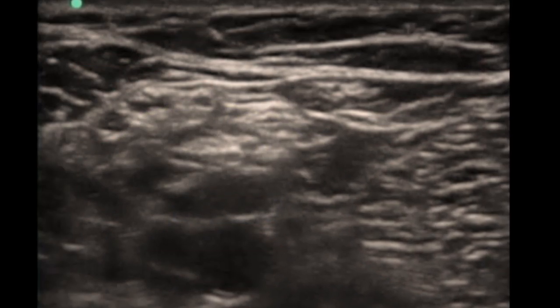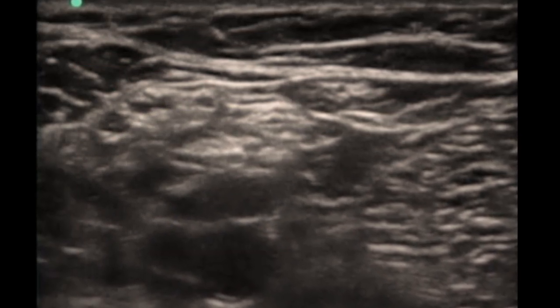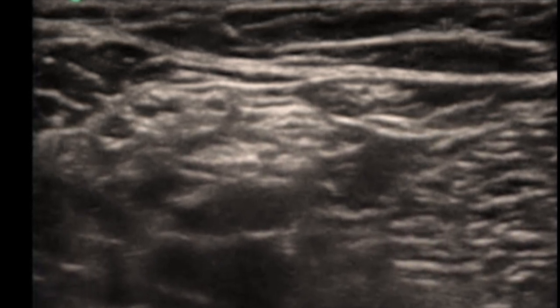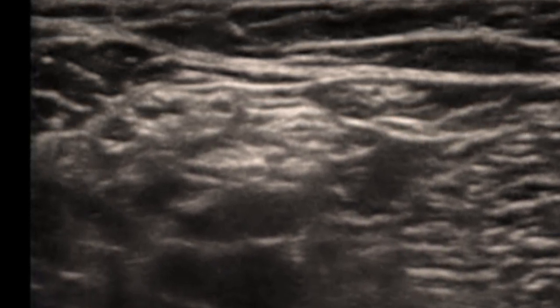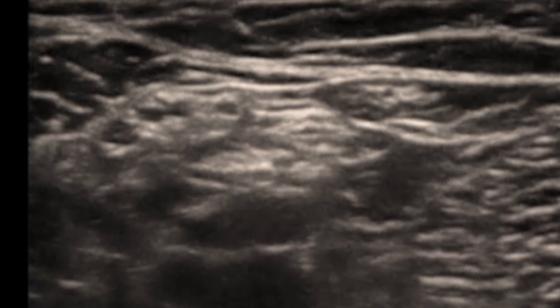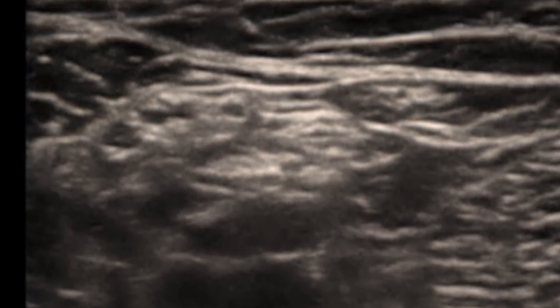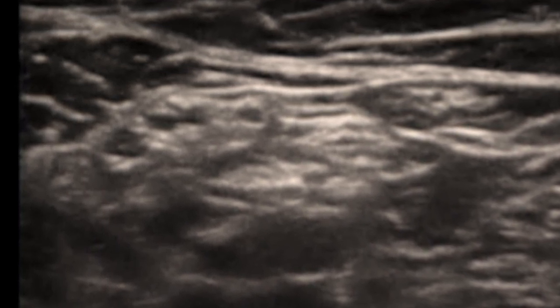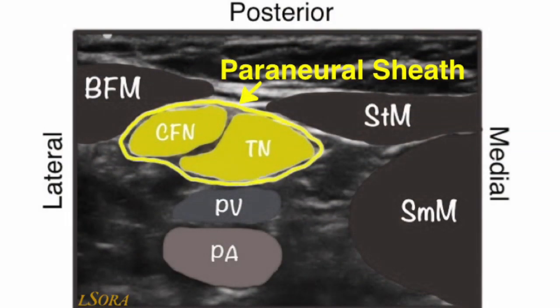In the centre of the screen, you will see the classical honeycomb internal architecture appearance of the sciatic nerve. It is viewed here as two separate components: the common fibular nerve laterally and the tibial nerve medially. This neural bundle sits above the popliteal vein and then the popliteal artery. On this diagram, you can see that the tibial nerve and common fibular nerve, although closely applied to each other here, are separate entities.